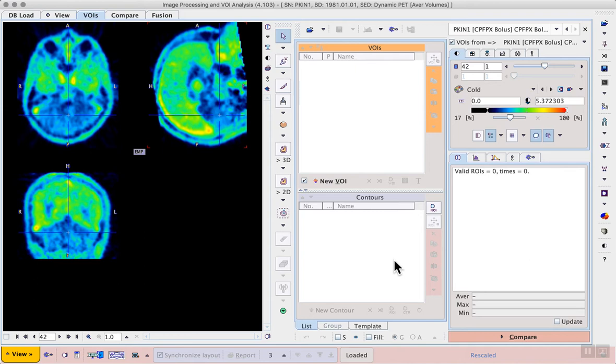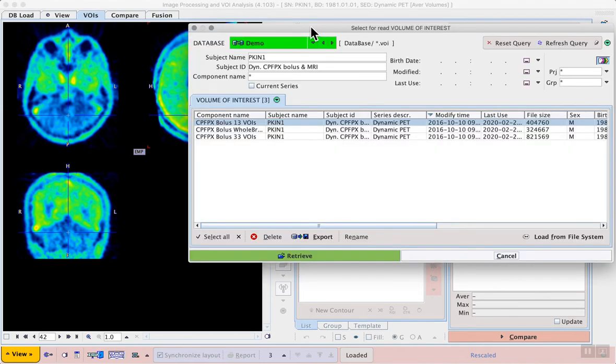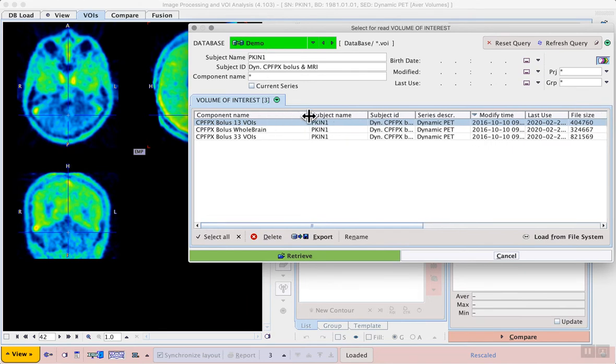To save time we can load pre-prepared volumes of interest. For this example subject we have three sets of VOIs available. Select the first one: CPFPX bolus 13 VOIs.